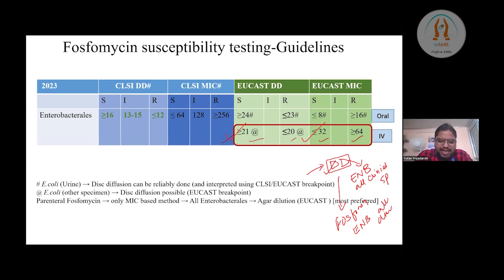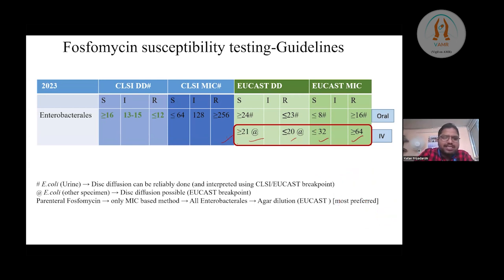In the entry screen, which will be shown subsequently, you have to write your zone diameters as well as MIC values in the entry sheet. Testing subsequently, as Saru will describe, is planned in such a way that all the ranges are covered nicely.